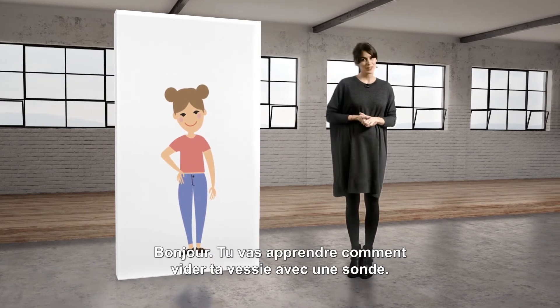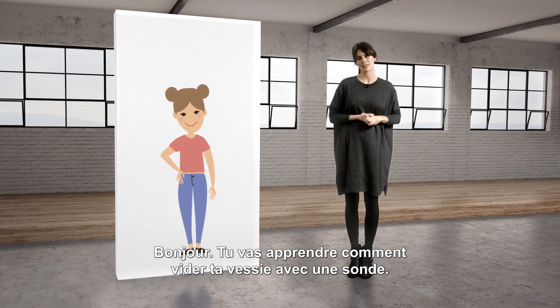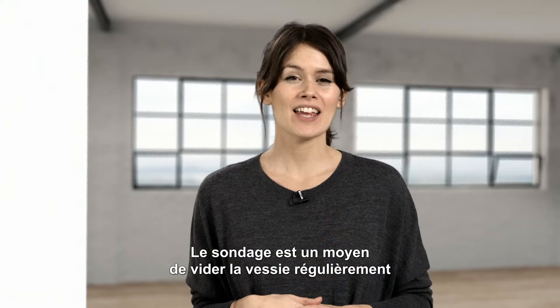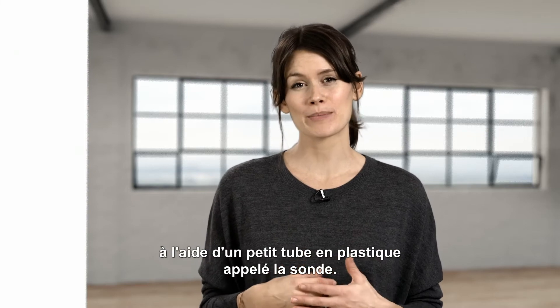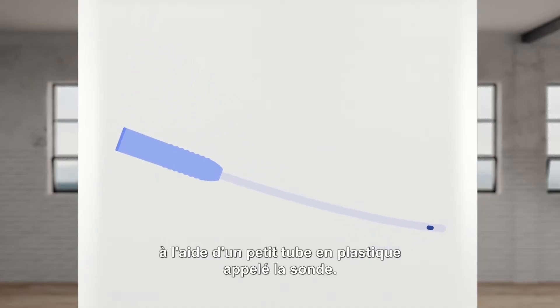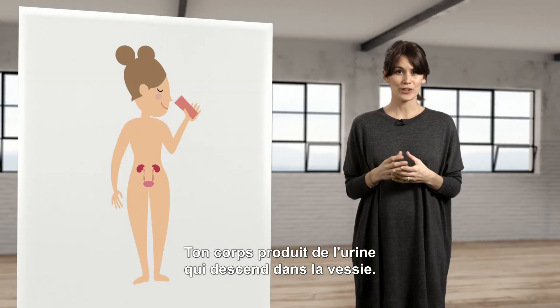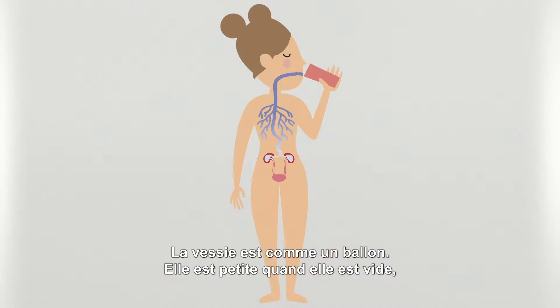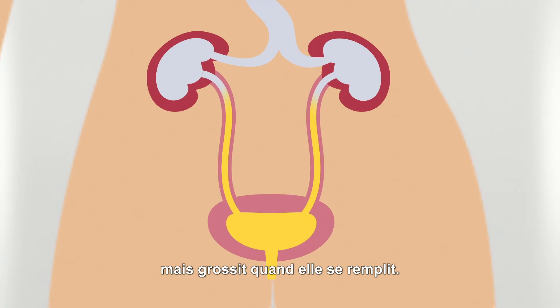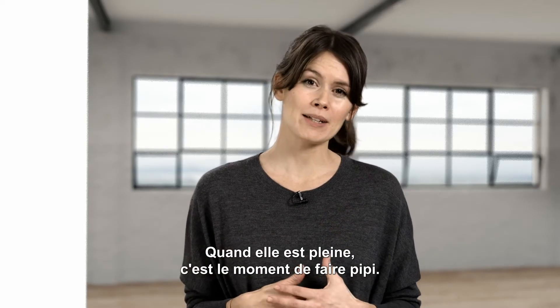You are now about to learn how to empty your bladder with an intermittent catheter. Catheterization is a way to empty your bladder regularly with the help of a little plastic tube called a catheter. Your body produces urine which goes down to the bladder. The bladder looks like a balloon — it is small when it is empty, but it grows in size when it fills up. When it is full, it is time to pee.